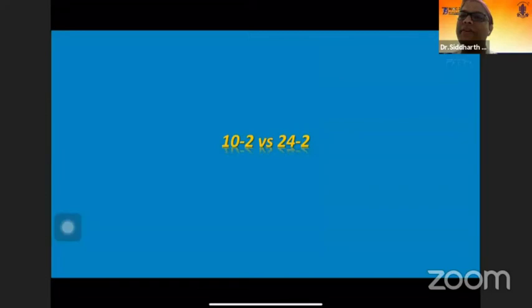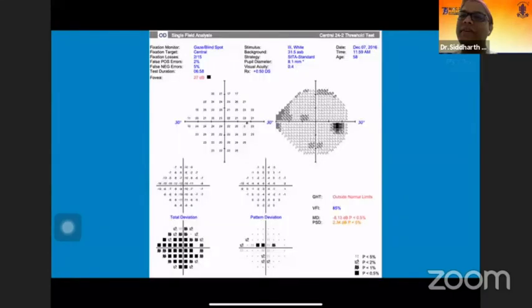There is an important aspect to remember: the 10-2 has a separation of only 2 degrees compared to 6 degrees on 24-2. So what seems like a defect, which may not even follow the Anderson's criteria, actually it does, but looks like a very minimal defect on 24-2, and you might think this is an early glaucoma.